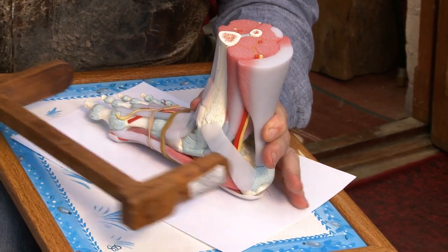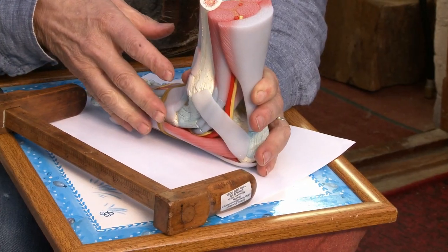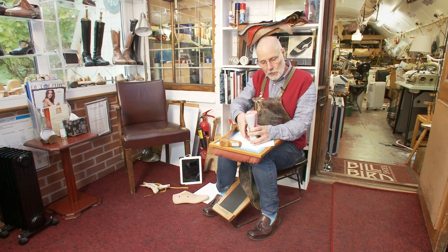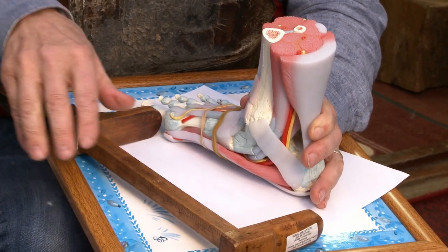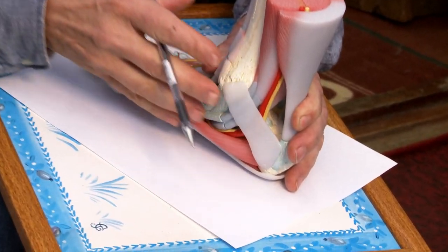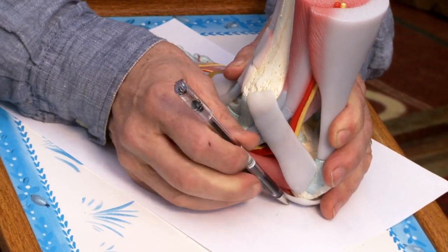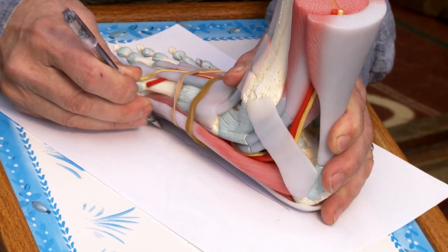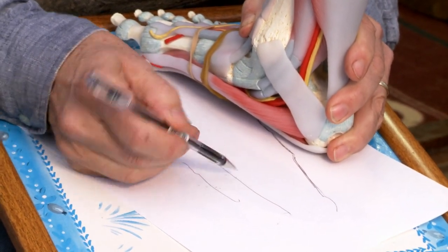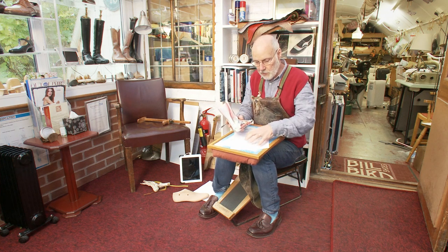Once I've traced the foot, I take a length measure with a stick while the client is standing. I then have the client sit, which allows the arch to relax and come back up, and I take a second length measure. Often the foot measures shorter in the sitting position because the arch has relaxed and the foot has shortened. With the foot sitting, I can also hold the pen at 45 degrees and 90 degrees to the axis, come under the arch, and create a line I can compare with the outside — using those two marks to predict both the arch shape and the outline.